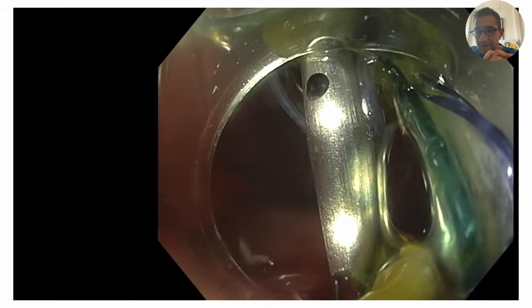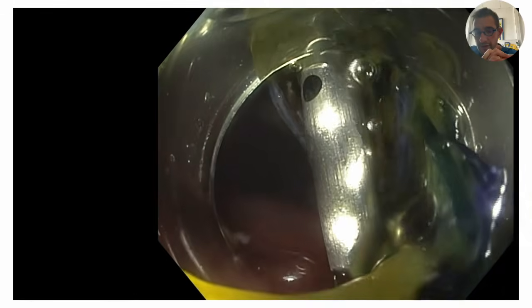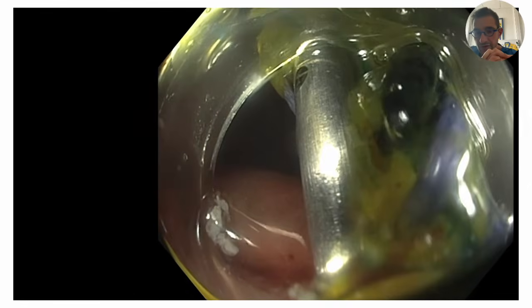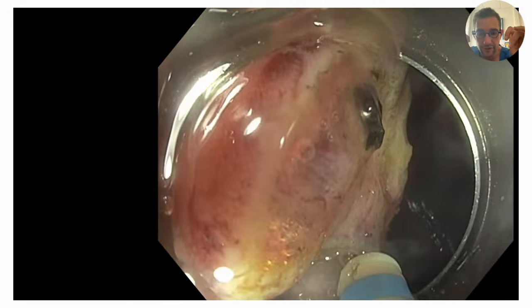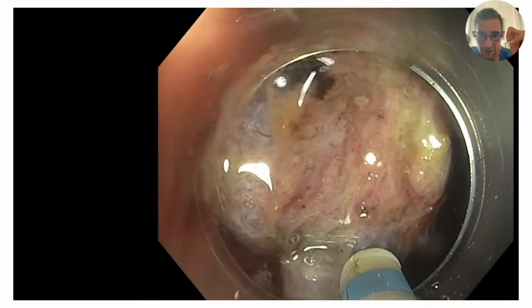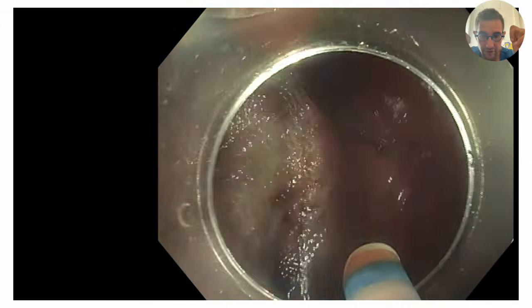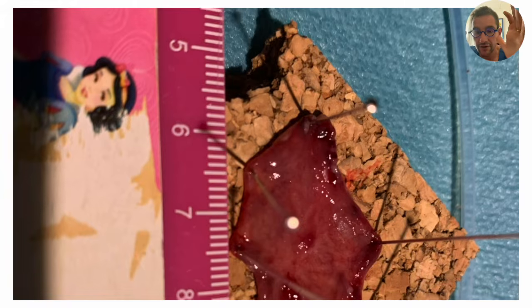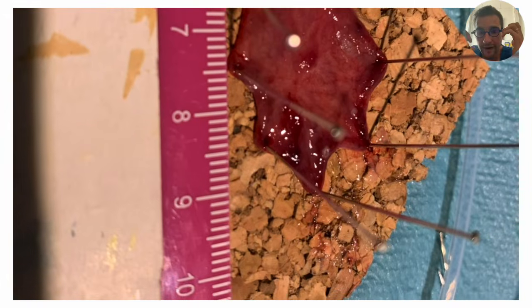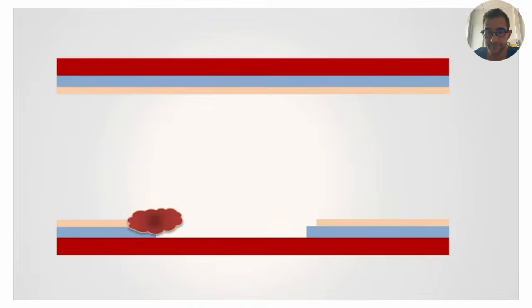So we should take time to enlarge and to stretch, not so strongly, the area, but thanks to this adaptive traction at the middle, when the space becomes very small, we can stretch again to expose this small blue layer at the depth of the fibrotic area. So yes, the space is smaller, yes, there is blue at the deepest part, but to expose this blue, traction is for me the best strategy and is stronger than only underwater or gravity.